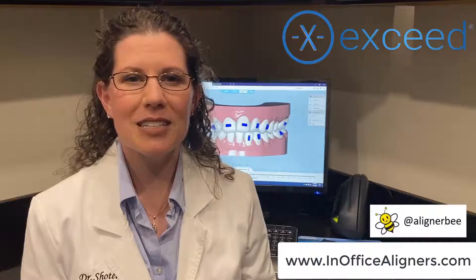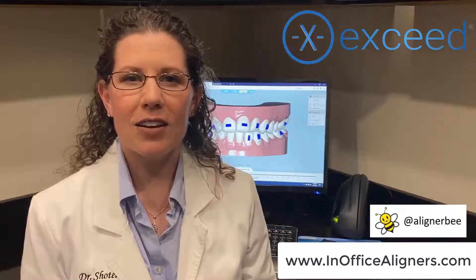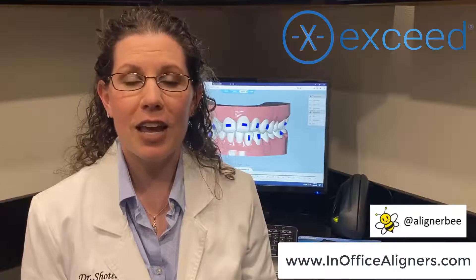This is ideal for the doctor that is ready to 3D print but does not want to design. By using eXceed, you'll be able to help reduce your laboratory cost from utilizing traditional clear aligner laboratories and doing the manufacturing in your office.